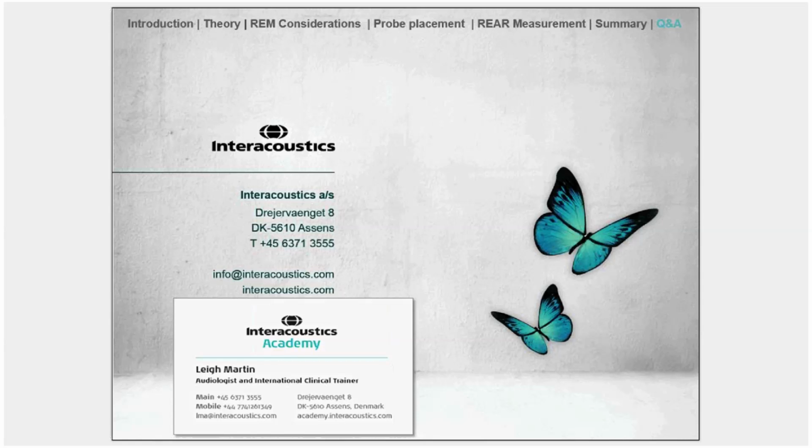And the answer to that question is, for me, I would always use a speech stimulus when actually measuring the hearing aid against a target, because the hearing aid is designed to amplify speech. So actually you want to see how well the hearing aid is responding to a speech-based stimulus.